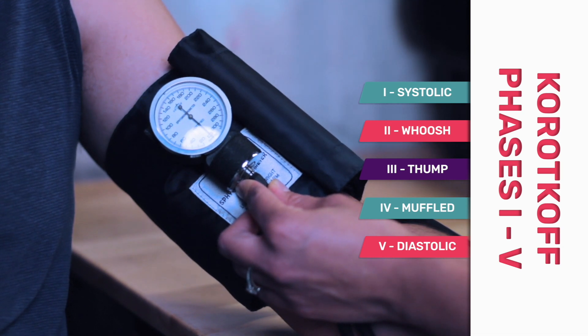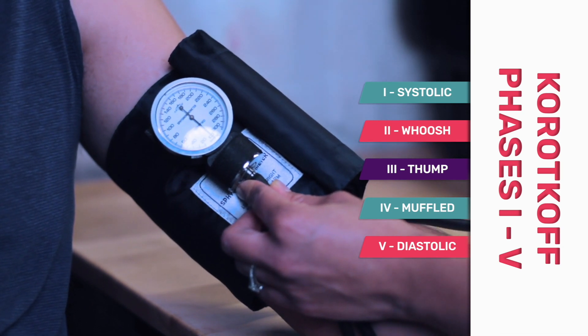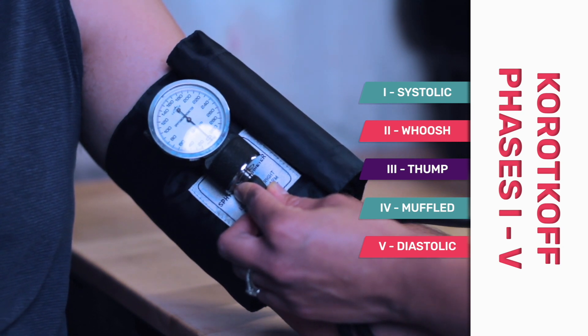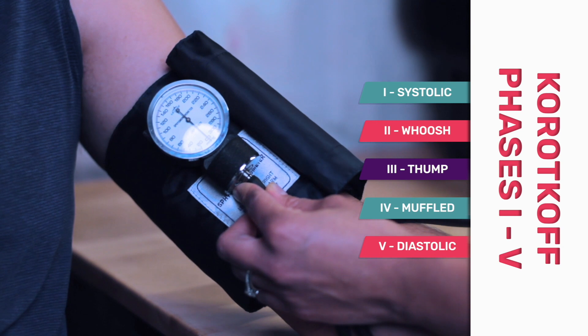And then in addition to that, phase two would be the whoosh, phase three would be the thump, and phase four would be a muffled sound. With phase five is silence. So that would be your diastolic.